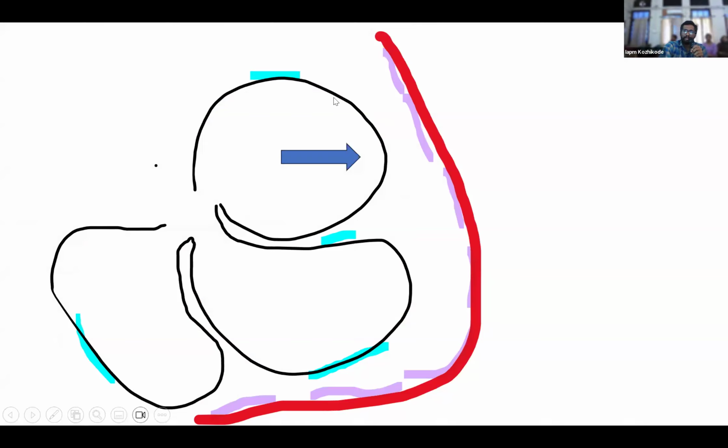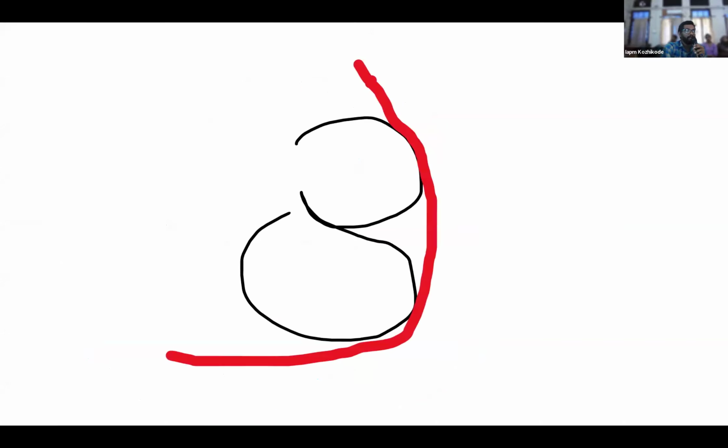So what in effect you are having, this is a podocyte. See, all the podocytes here have gone. This area is bare. Whenever two such surfaces are bare in the human body, what will happen? They will form synechia. You can see the same thing will happen in the lung or in the pericardium or anywhere.